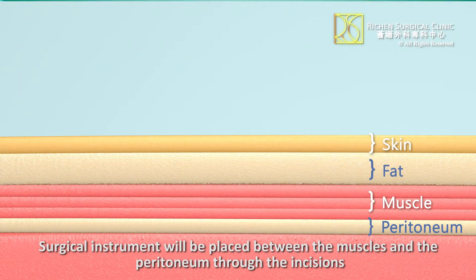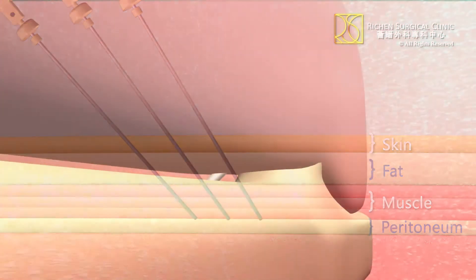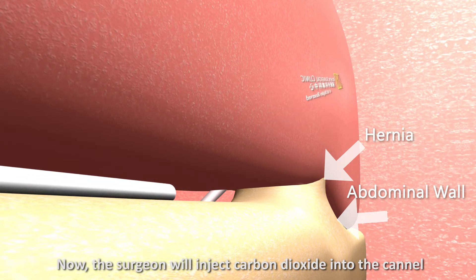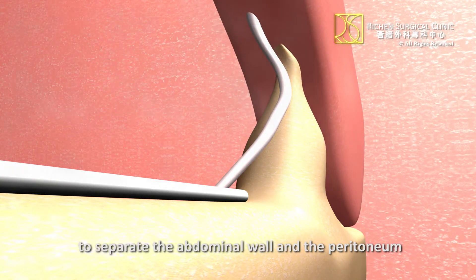Surgical instruments will be placed between the muscles and the peritoneum through the incisions. The surgeon will then inject carbon dioxide into the canal between the peritoneum and the sites of herniation to separate the abdominal wall and the peritoneum.